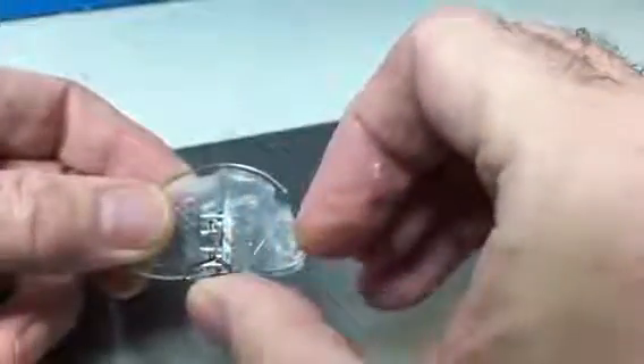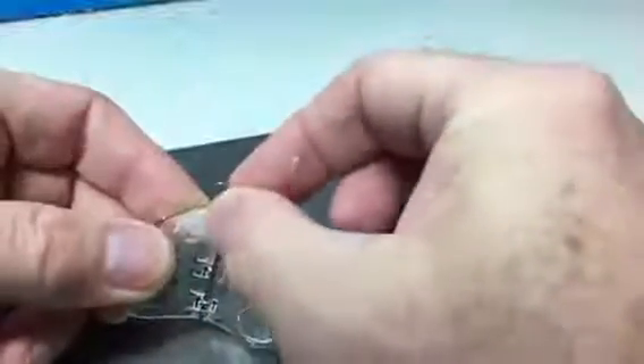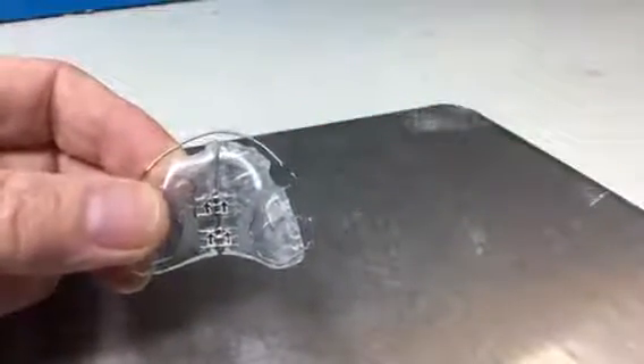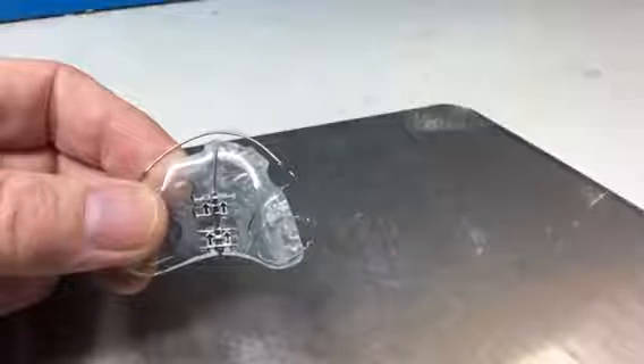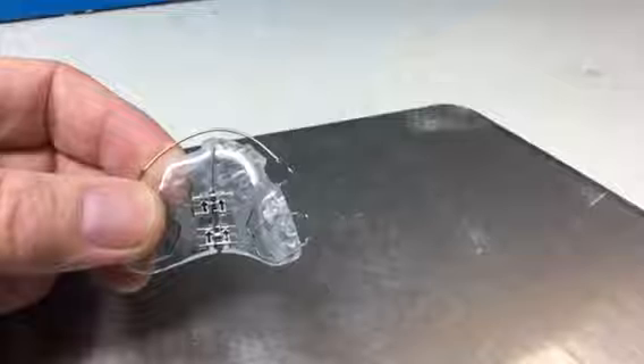I'm putting the key in the little hole and one quarter turn is where you put it there and move it there. That's one quarter turn and you do that to both screws. In a mixed dentition case like this you can do it one quarter turn every five days. One quarter turn is one quarter of a millimeter.